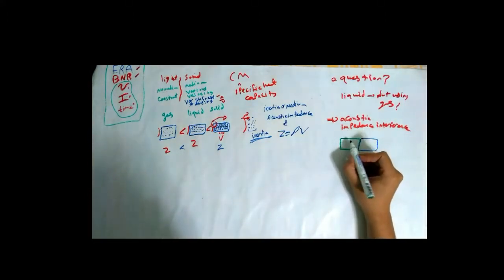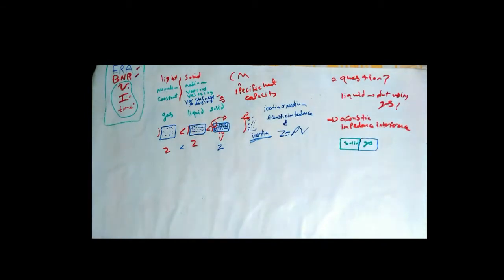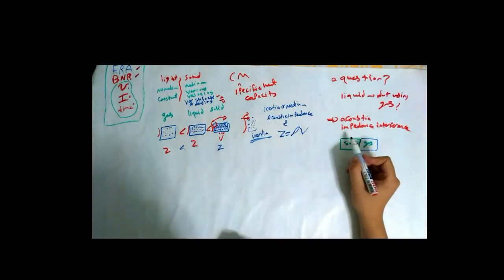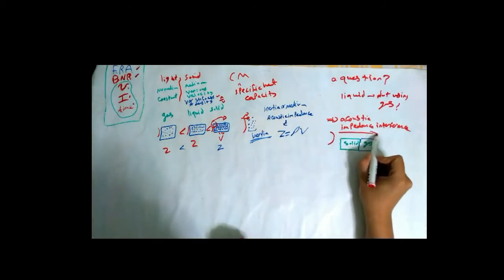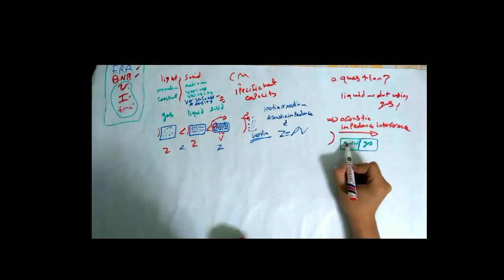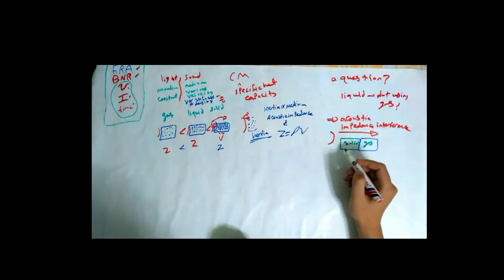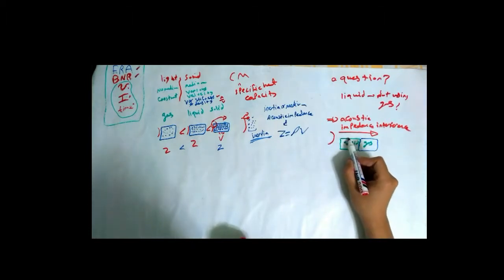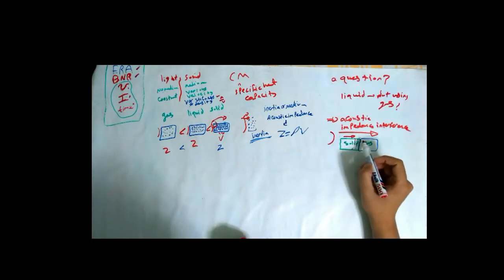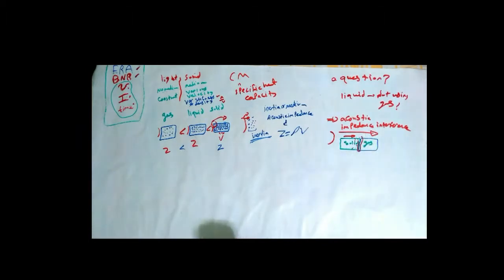when the sound wave is propagating between different materials. Let's say this is solid and this is gas. Let's say we have now a sound wave propagating in this direction. First, the sound wave will propagate through the solid and will have a resistance from the solid, which is acoustic impedance, to the motion of its molecules as the sound wave is propagating through it. Then, when the sound wave is propagating through the solid, it will reach a distance where the atoms of solid and gas meet each other.